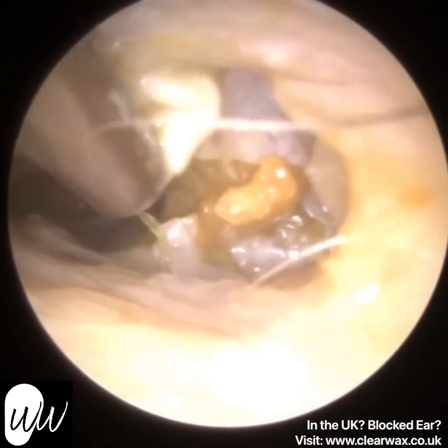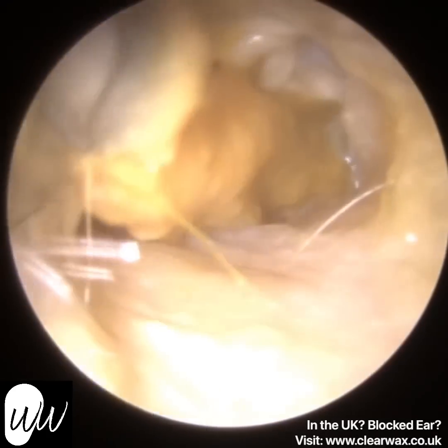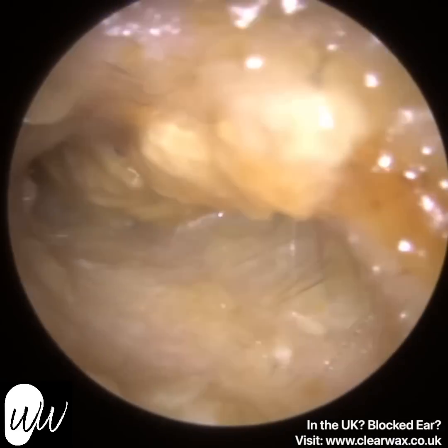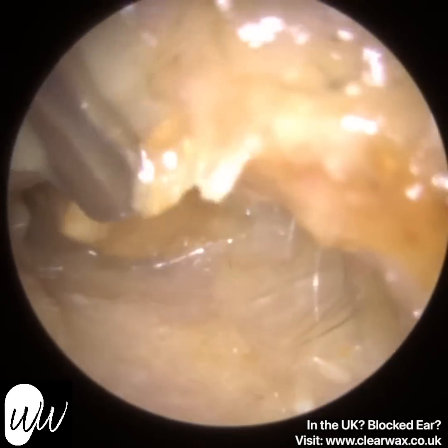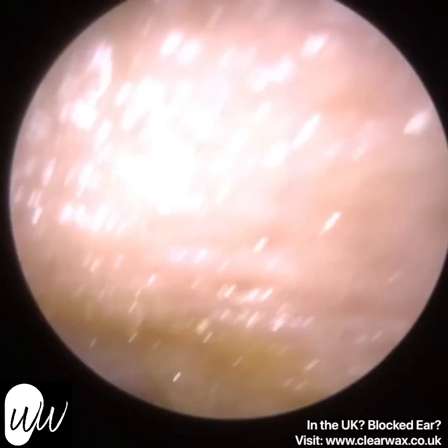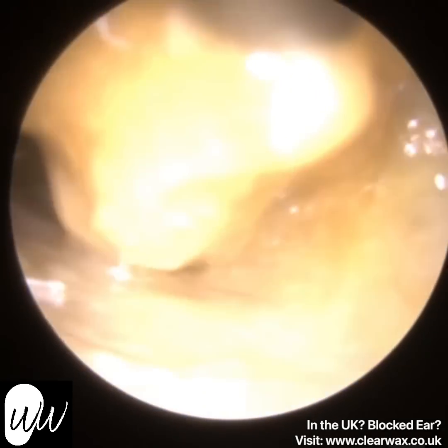And we can see here, I'm just using a fine end suction probe actually because the ear is quite swollen, it's inflamed, there's not much space in there. And I'm just using the fine end suction probe to suction out this wet debris. You can see it's really slushy almost in consistency. And it's really impacted, it's really deep in the ear.